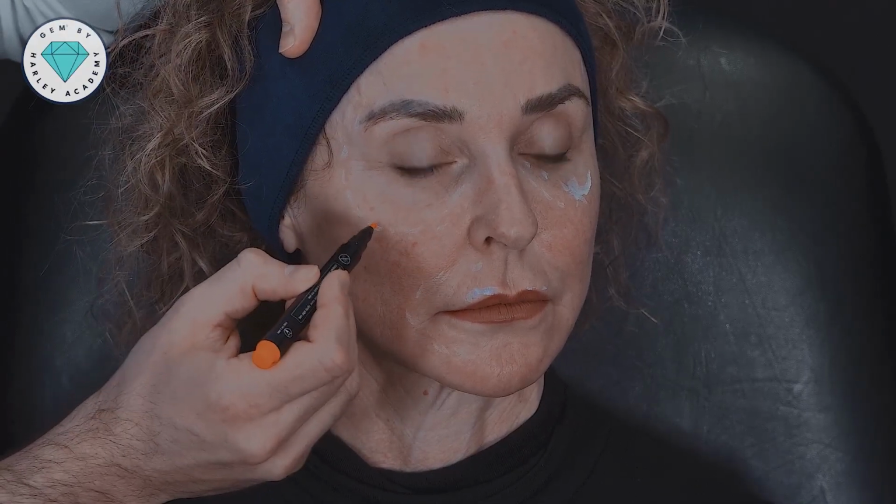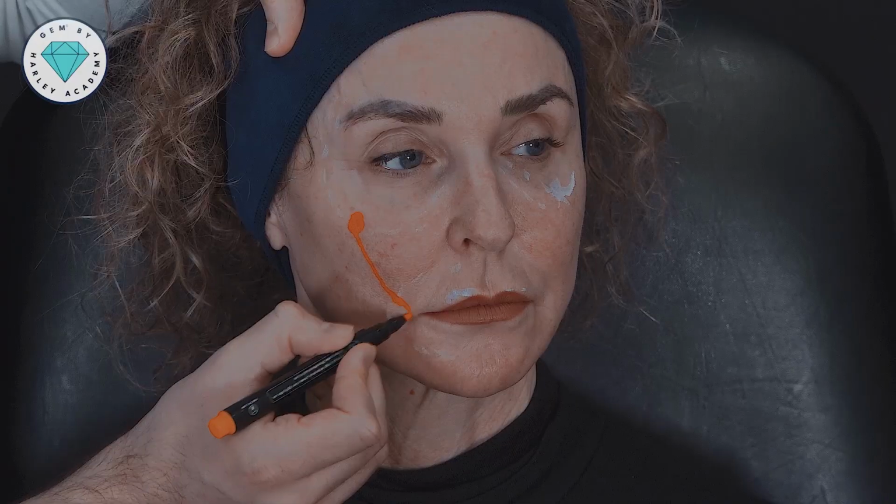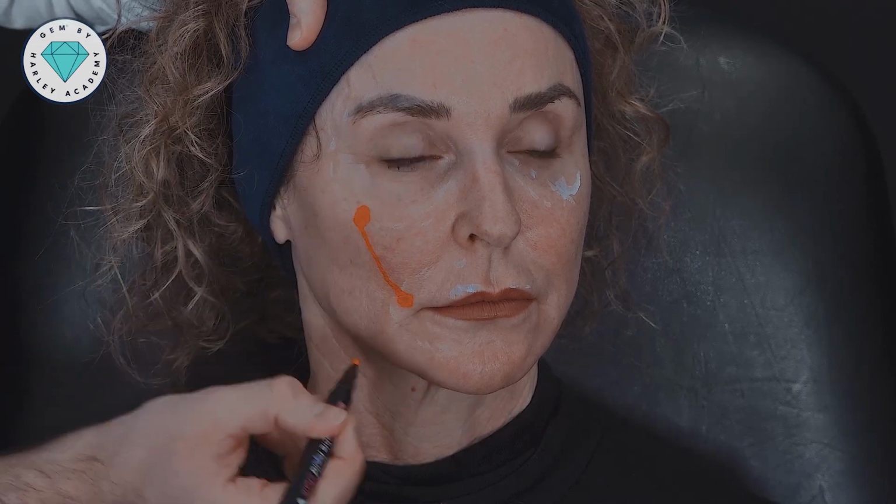One thing to understand here is that the zygomaticus major muscle, which originates from the zygomatic arch down to the modiolus of the mouth, actually acts as a septum that goes all the way from the skin down to the bone. In doing so, it creates a lateral boundary for the filler.